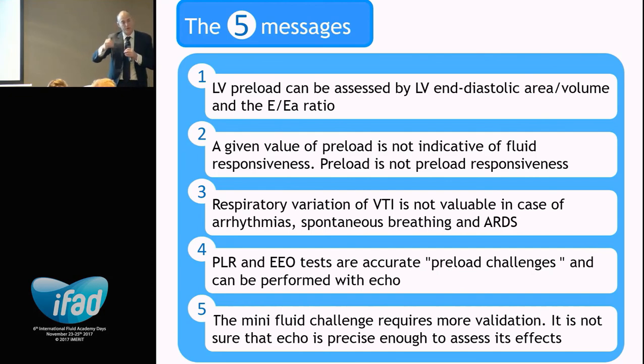I'm not sure that echo is precise enough to assess so small changes, so it's the reason why I think that the mini fluid challenge requires more validation, but it is not sure that echo is precise enough to assess its effects.